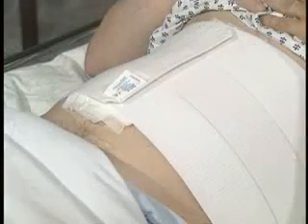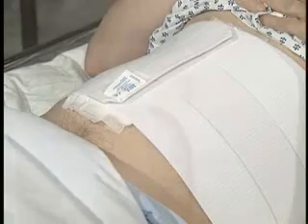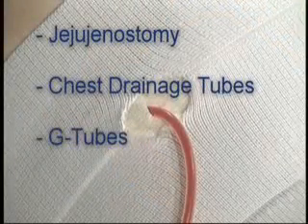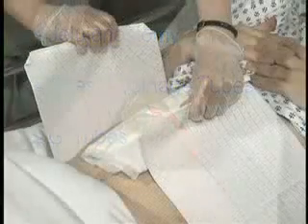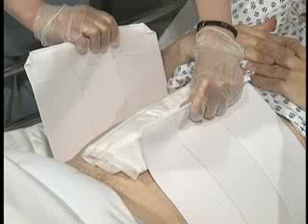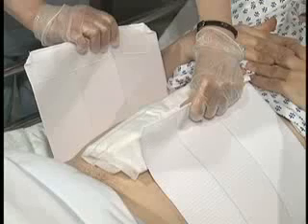The Dale abdominal binder is ideal for holding wound dressings and accommodates the use of surgical tubes, as well as jejunostomy, chest drainage tubes, and G-tubes. Prior to applying the binder, surgical sponges or ABD pads should be placed on both sides of the drain to prevent excessive pressure on or occlusion of the drainage tube. If open system Penrose type drains are used, holes should be cut to accommodate the tubes.